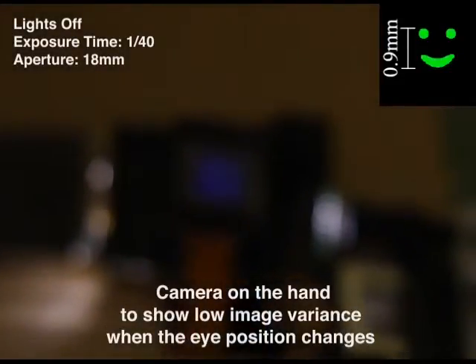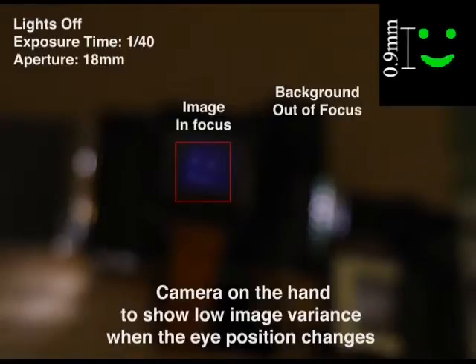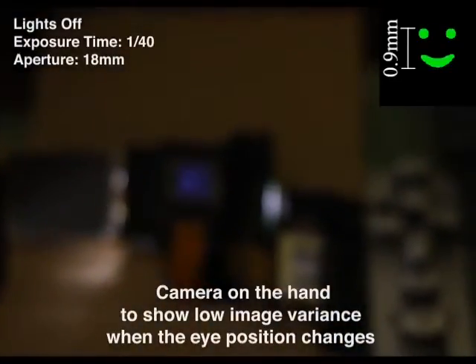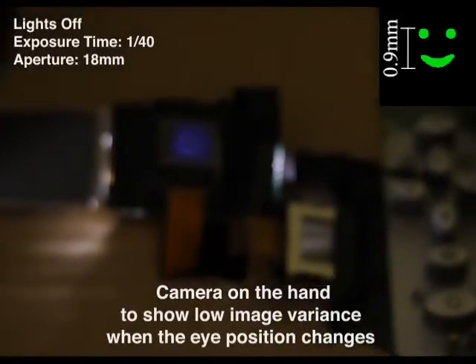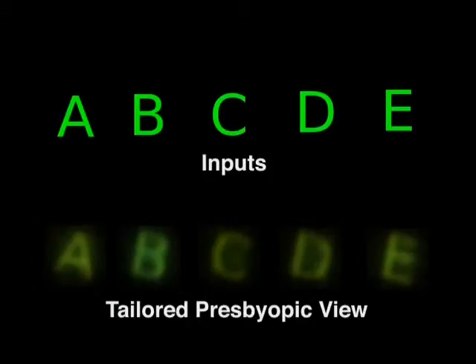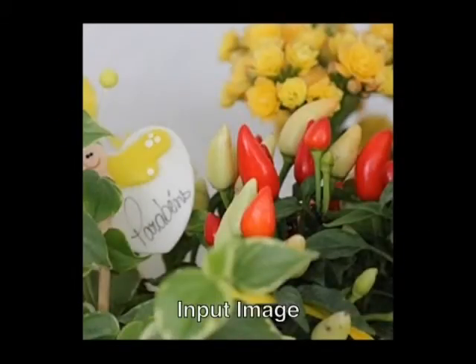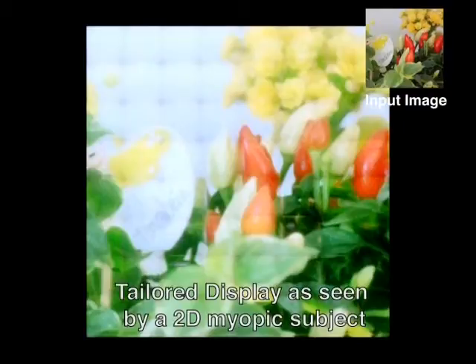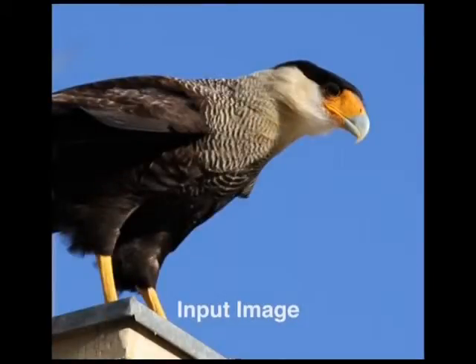We evaluated our displays in 3 rounds. First, on tiny binary images to investigate the suitability for inexpensive LCDs to produce sharp images at retinal resolution for a variety of eye conditions. Second, bigger colored light fields to investigate how an array of those LCDs would be captured by the imaging system. And finally, by user evaluations to check the ability to correct small images on the human eye.